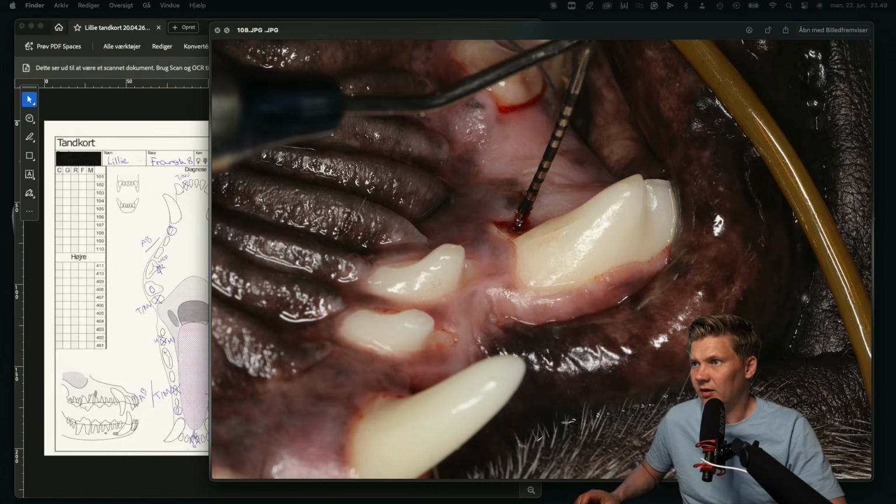No. But anyway, this is also this area where you have the contact of the lower molar on the upper fourth premolar, causing a little bit of bone loss, this is 3 to 4 millimeters of pocket. The way we did here is it wasn't enough to extract the tooth, so we went down and I cleaned it up with some curettes, and we're going to check it out next time.